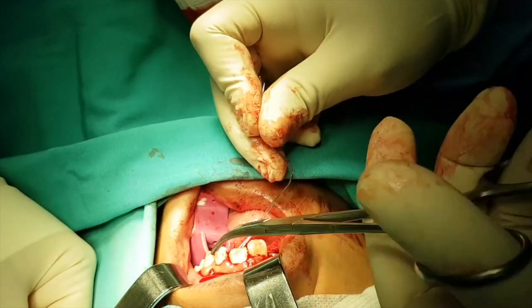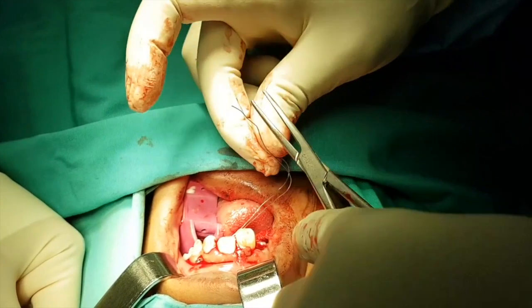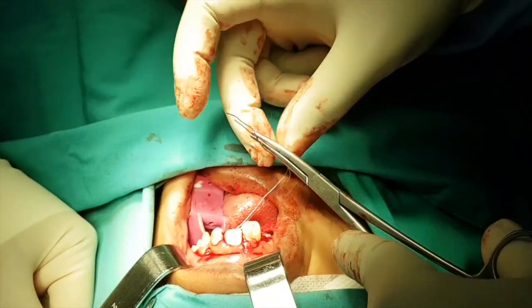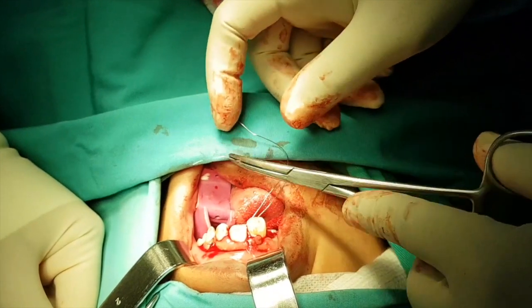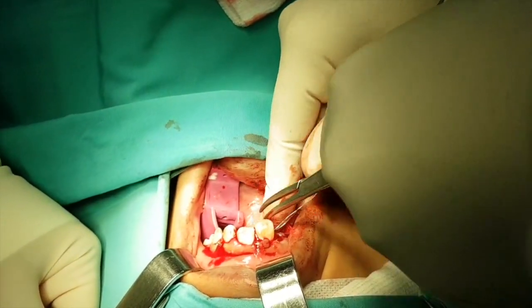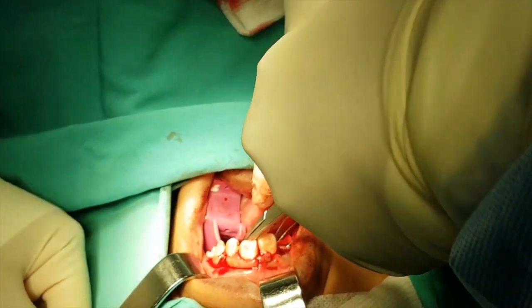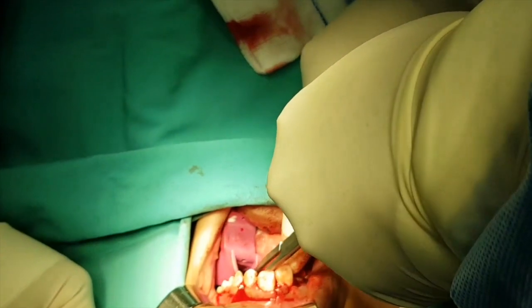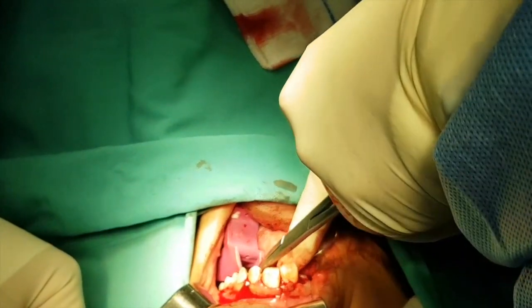In this case, as you can see, rather than using resin and arch wires to stabilize those remaining teeth, we decided not to use resin because we could not guarantee good isolation. Therefore, ligature wire is still the best and tried-and-tested technique in stabilizing these central incisors into place.